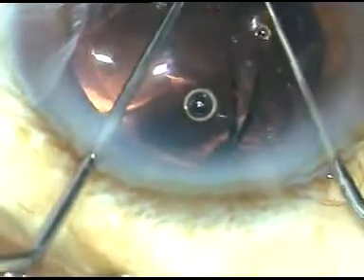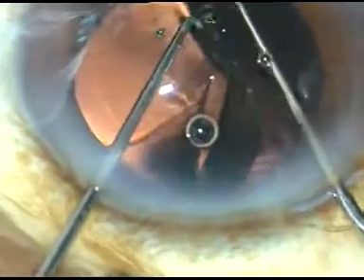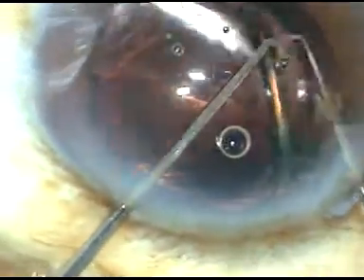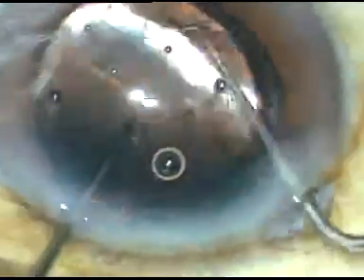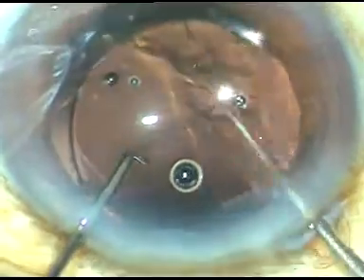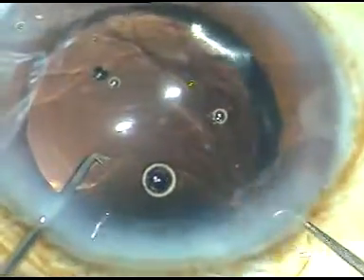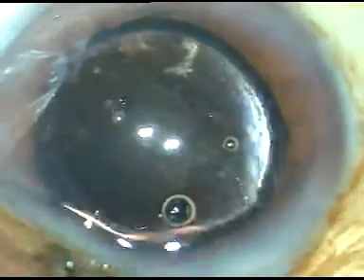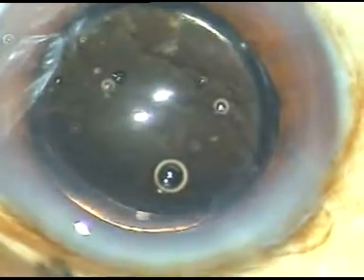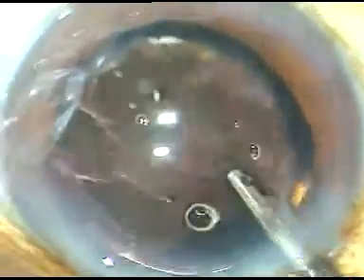The trailing haptic has stuck to the side of the optic, and it has been teased and released. Now, the lens is dialed, the posterior lip is depressed, and some amount of viscoelastic substance comes out, and now I'm going to spend about 1.5 minutes to remove the viscoelastic substance.